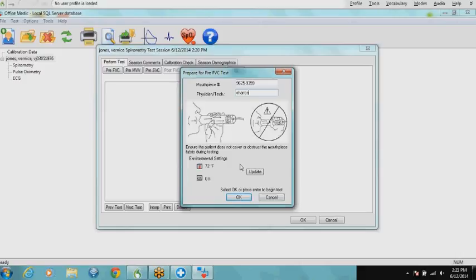The graphic located underneath there is a reminder on how to instruct the patient on how to hold the mouthpiece. We never want them to cover up the mesh vented end of the mouthpiece nearest the pressure tube, as that will probably force foreign matter down through that pressure tube, creating a cross-contamination issue. And we don't want that to happen. Also, the result of the test will be off the scale.